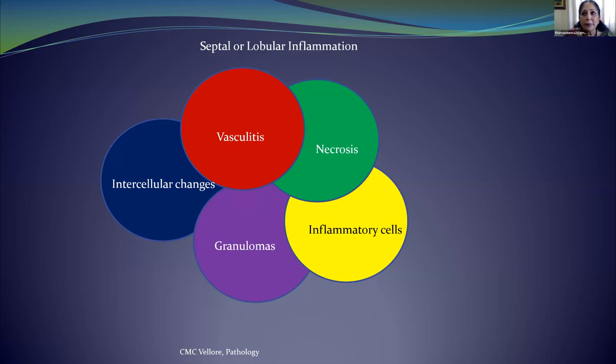Then you look at the inflammatory cells, NLHE. Easy to remember. If it's inflammatory cell in the first few, then you always must do special stains to exclude the infective etiology. Otherwise, think of non-infective causes of panniculitis like lupus or an SPT or a lymphoma.